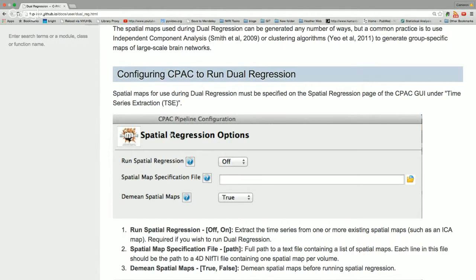So instead of doing what we typically consider in a GLM, which is a temporal regression, where we have a template that is a pattern across time, and we're comparing that to a time course, now our template is a pattern across space, and we're comparing it to each brain image that we acquire. And as a result of that, you get a time course that are the beta values estimated for each one of your images, right? Each one of your fMRI volumes.